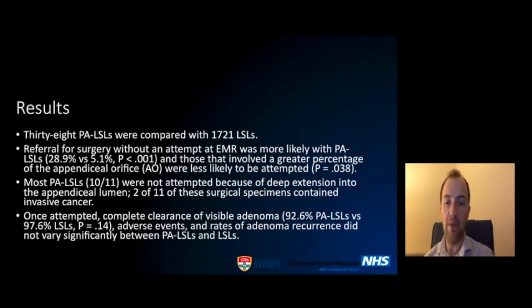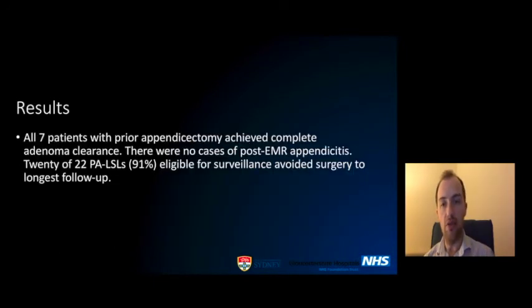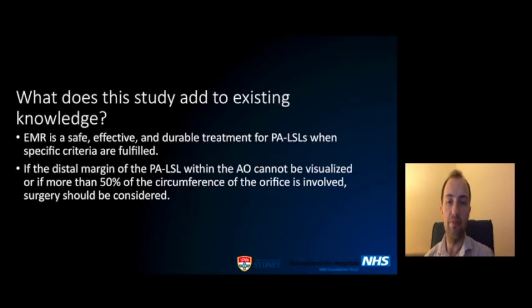However, once attempted, complete clearance of visible adenoma was very common, and adverse events and rates of adenoma recurrence were no different to standard lesions. In addition, 7 patients with a prior appendicectomy achieved complete adenoma clearance, and there were no cases of post-EMR appendicitis.